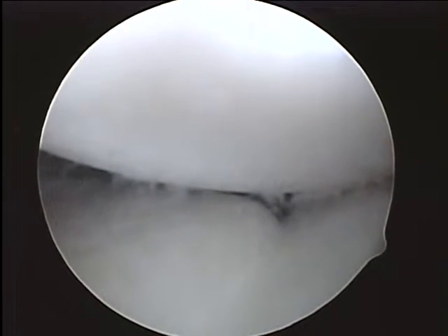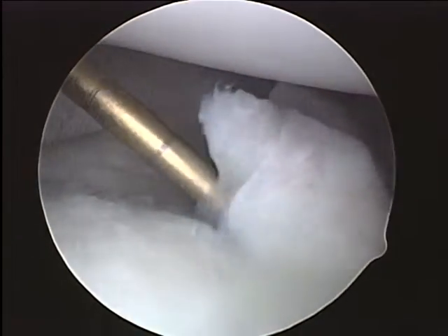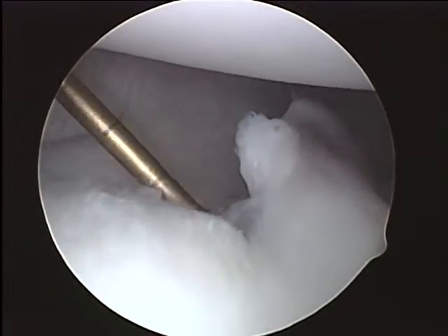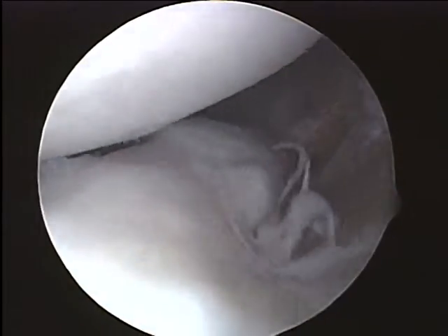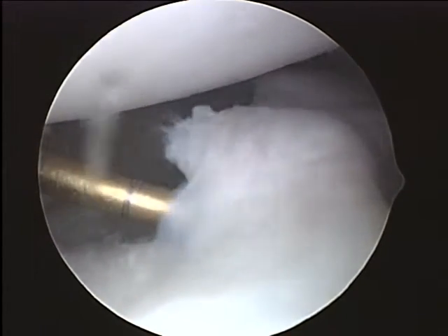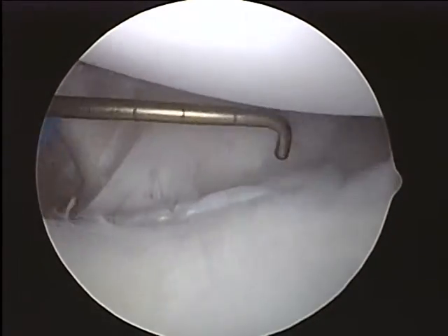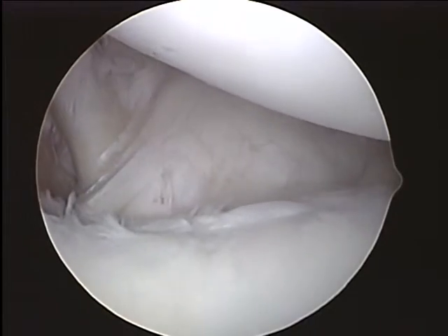Lift the arm up again, please. This anterior inferior parrot beak glenoid labrum issue, which I think we want to trim out of here. But I don't think it's going to make things any more unstable to change that, because that's not contributing to anything. And then, of course, the big thing, I think, is getting that screw out of there, both for the front symptoms and back symptoms. So good. And a pretty good looking joint, despite having had all these issues over the years. So we have the shaver next.